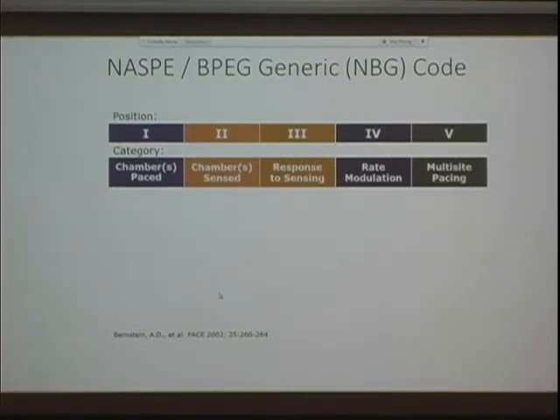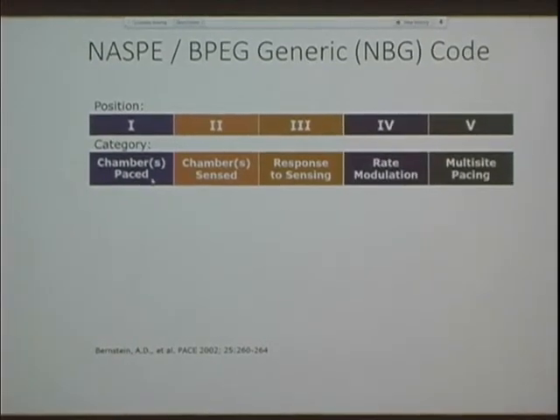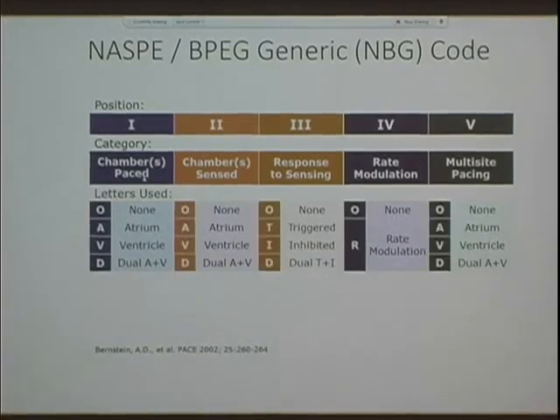When you look at the pacemaker clinic note, you'll see the mode that's mentioned, whether it is AAI or DDDR. What does that code mean? The first letter stands for the chamber that is paced, because that's what pacemakers do, they pace. So the very first letter is telling you what the pacemaker is going to be pacing, whether the atrium or the ventricle or both.